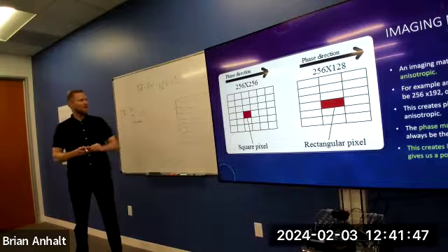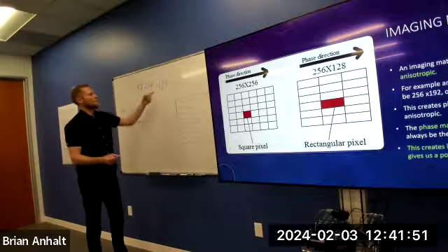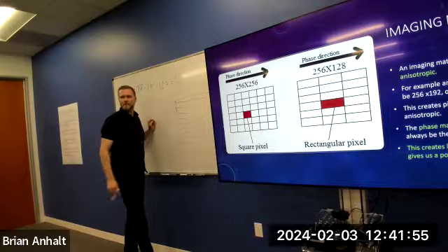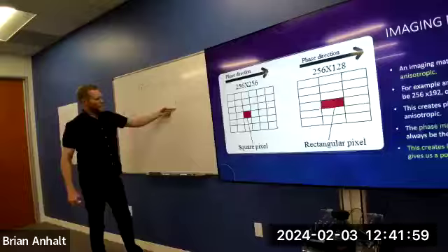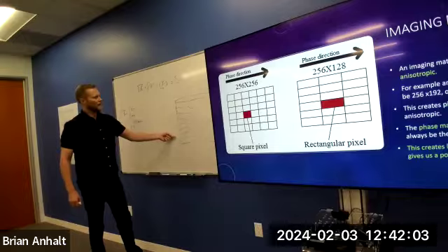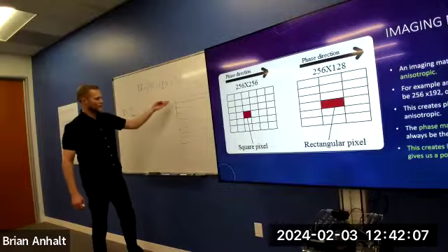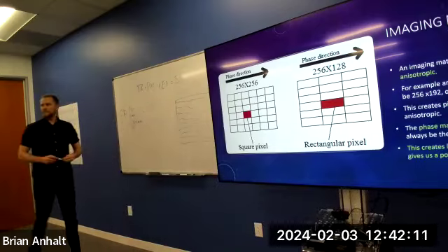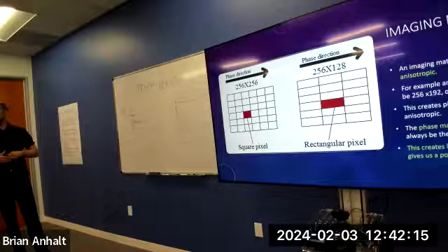And then in addition to that, what does NEX tell me? How many times I fill each one of these, right? So I have to fill 1, 2, 3, 4, 5, 6, 7, 8 echoes in this case, right? It takes me 3 seconds to fill 8 echoes, and then I have to do it 2 times. That gives me my scan time right there. Amazing.